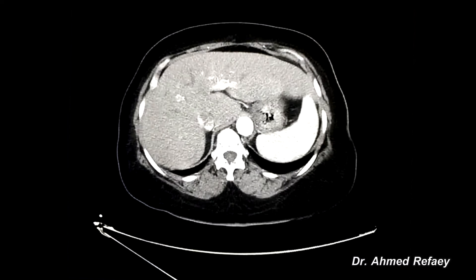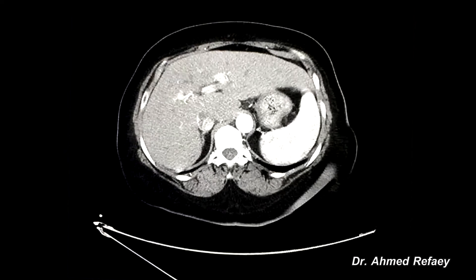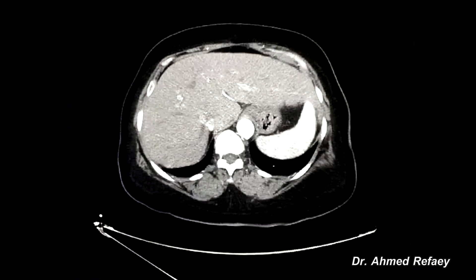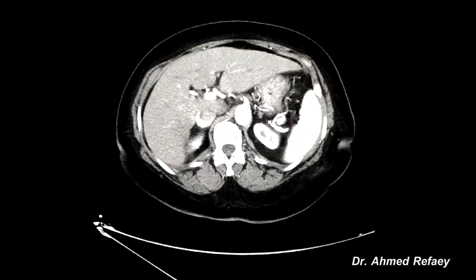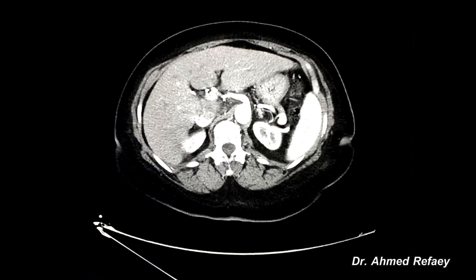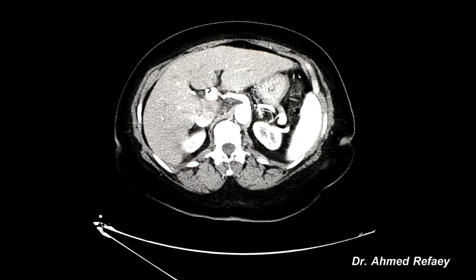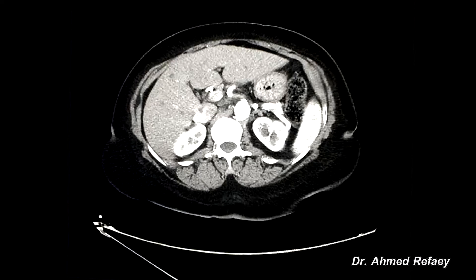The arterial phase means imaging of the liver after 35 seconds from the start of intravenous contrast administration, when the contrast reaches the liver through the hepatic artery. This is the celiac trunk and this is the hepatic artery. In this phase we can detect any hypervascular tumor in the liver.